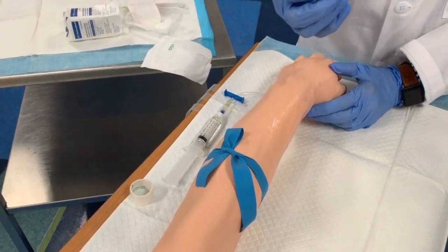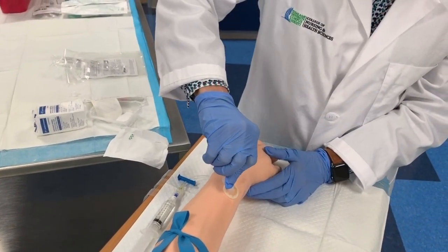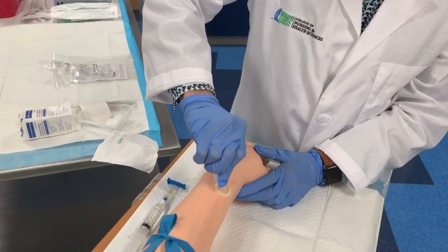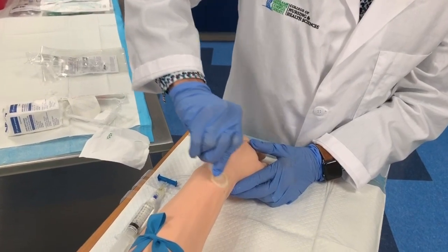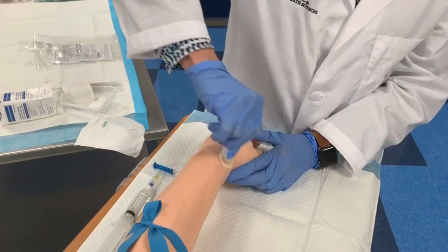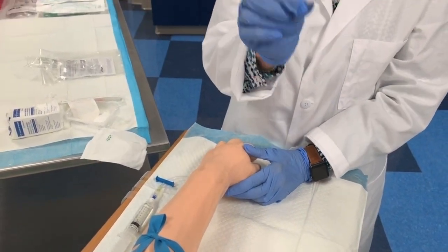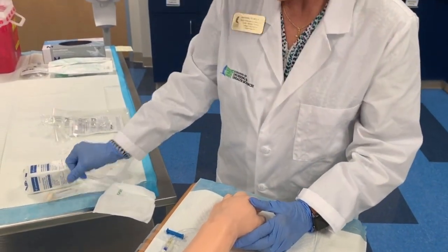Now, if this were an alcohol-based gel, the way you want to use that is we want to start in the center where our proposed stick site is, and then we're going to come out in concentric circles in a large area. And I usually like to cover the area where the Tegaderm is going to sit. So depending on what your cleanser is determines how you're going to clean the patient.